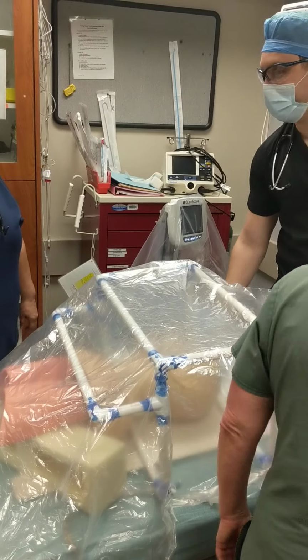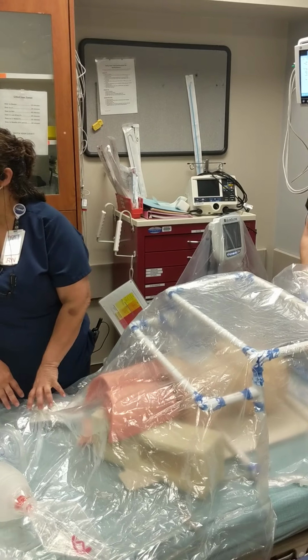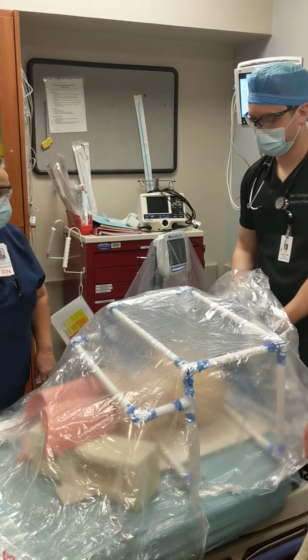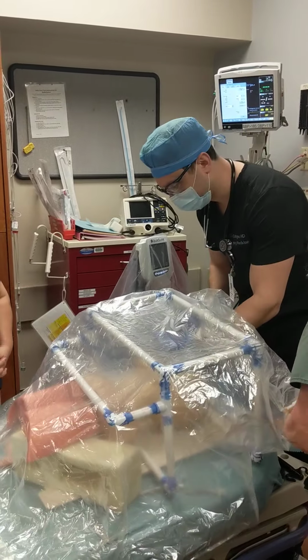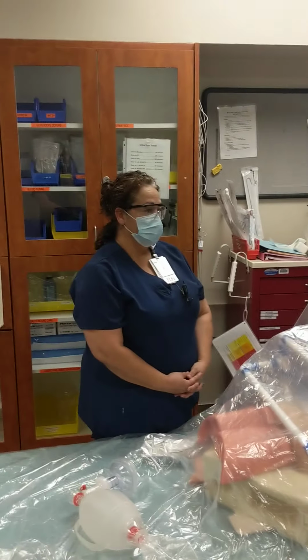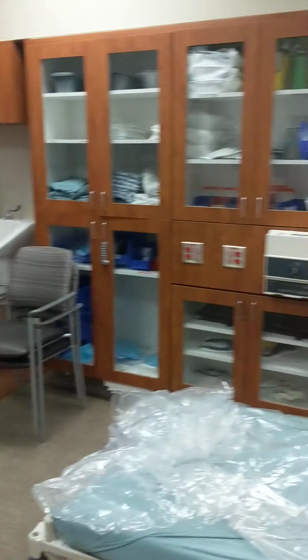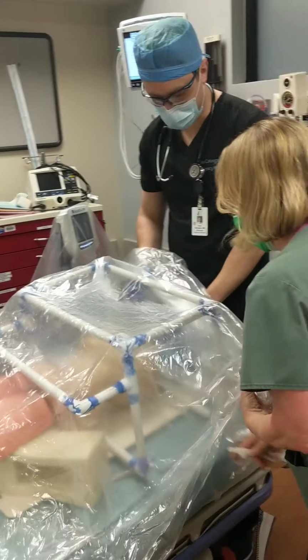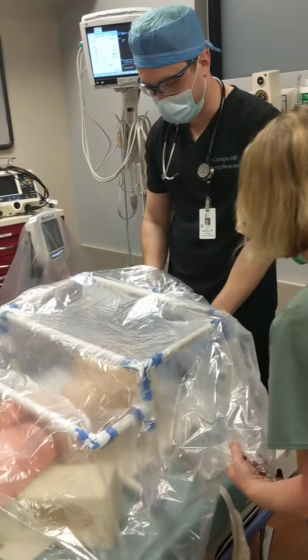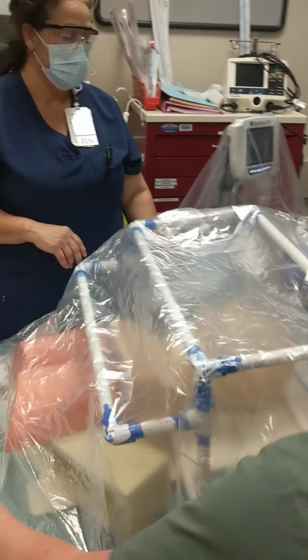Okay, so we'll push the meds. Pushing meds for rapid sequence intubation. The nurse is going to be giving orders to a nurse who's documenting outside the room, right? Yes. Okay, cool. And there's an extra respiratory therapist outside the room to hand extra supplies if needed. And we'll have suction set up under here. We'll have the ambu bag if necessary.